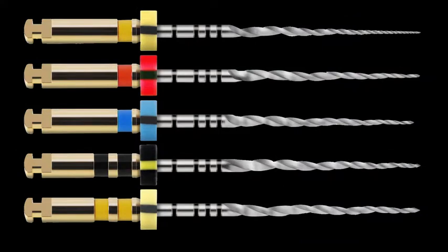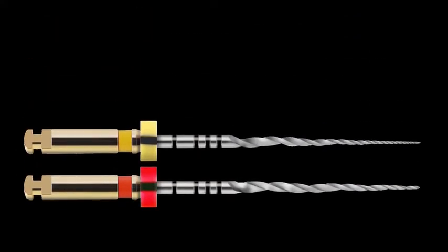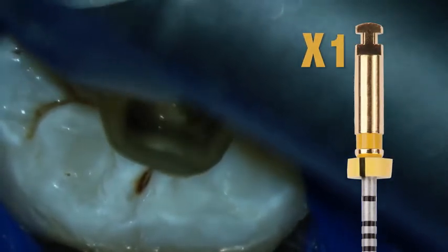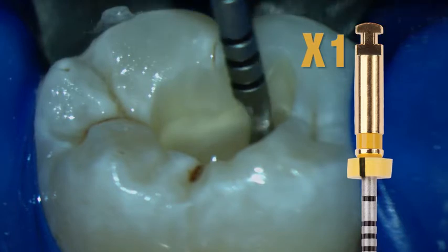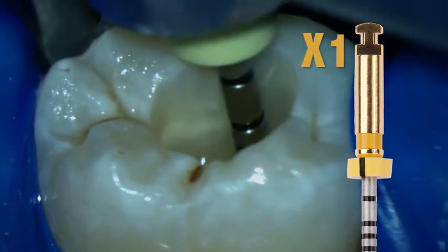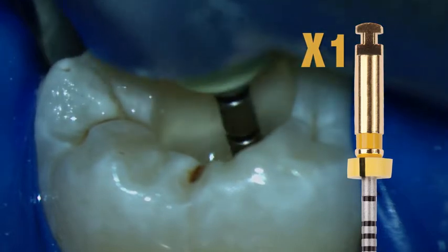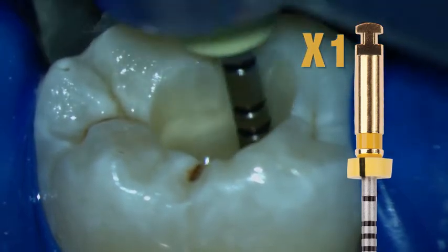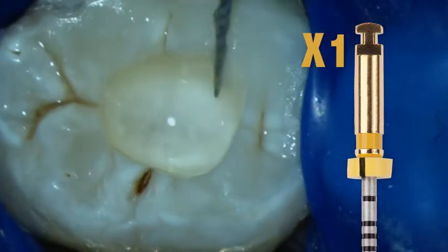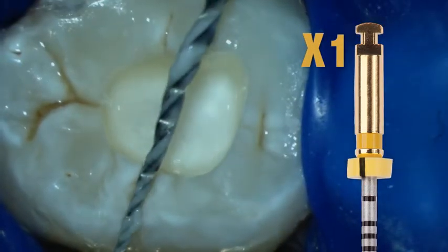Most canals can be prepared with just two of the ProTaper Next instruments. The first instrument in the sequence is always the X1. The instrument is used in essentially a push-pull fashion over a short amplitude of 1 to 2 mm. It should be noted that the use of ProTaper Next does not require brushing, but we show some here because many find this useful in removing restrictive dentin in the coronal one-third of the preparation.